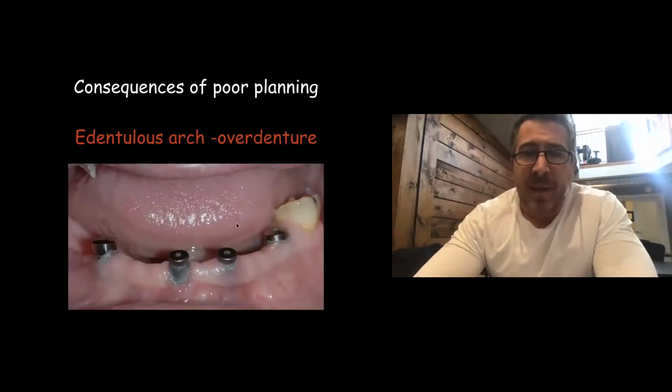This is poor treatment planning. I didn't do this case, but this is somebody who fired 4 implants in after they extracted the teeth without any kind of understanding of what was going to happen. I guarantee you, and I know from listening to the patient, they had the teeth removed with no flap and the implants were placed in through the sockets.